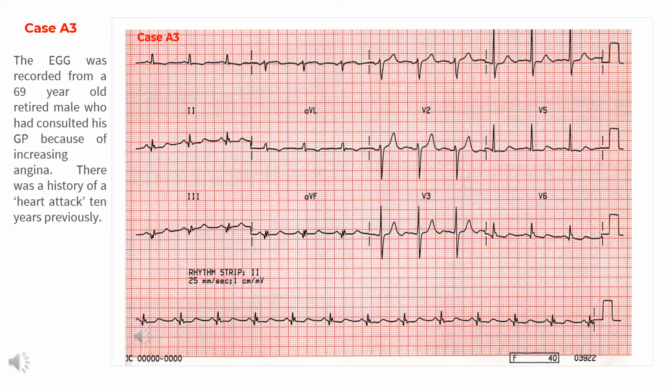Case 3. The ECG was recorded from a 69-year-old retired male who had consulted his GP because of increasing angina. There was a history of a heart attack 10 years previously.